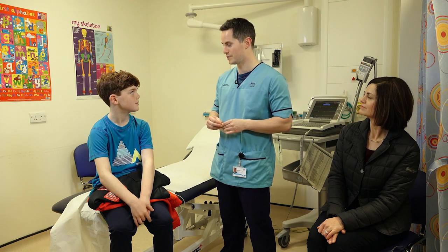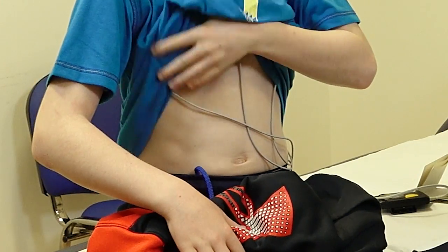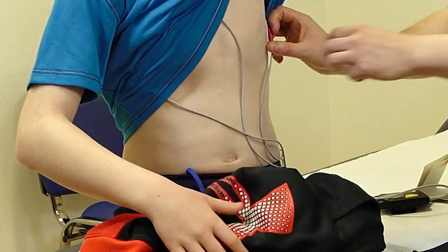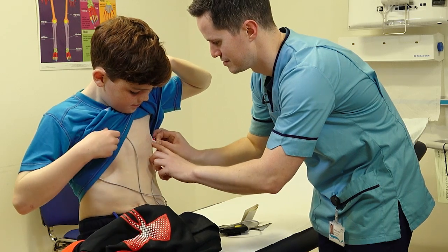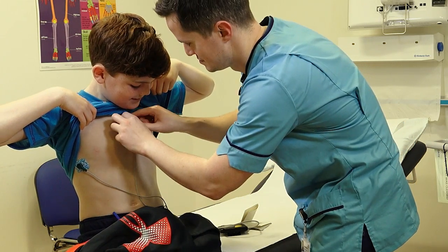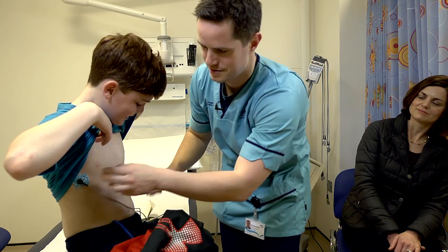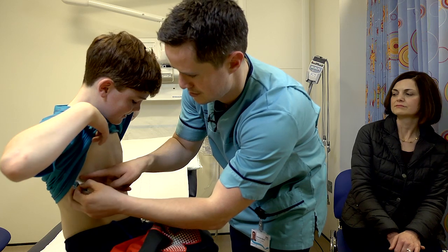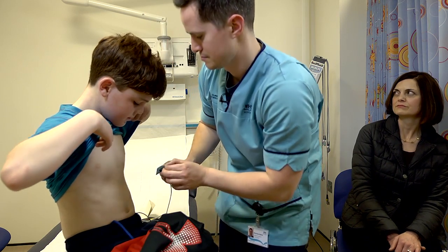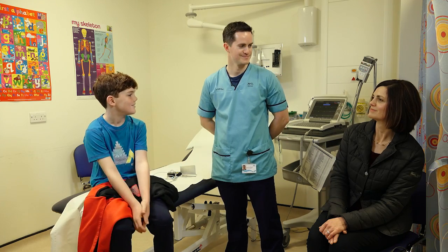So what we'll do now is relieve you of the monitor. These can be a little bit sticky coming off. Thank you for showing me how this works. No problem, Sam. Enjoy the rest of your day. Thanks.